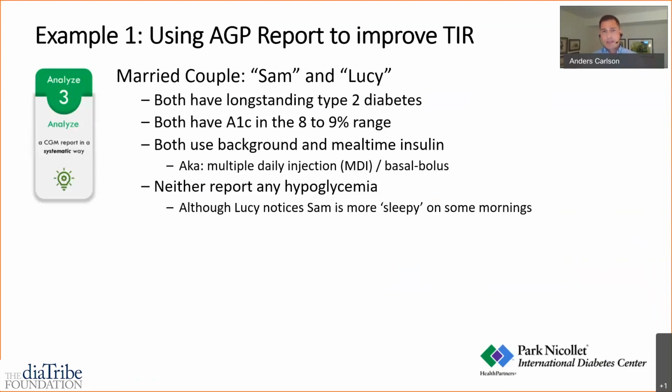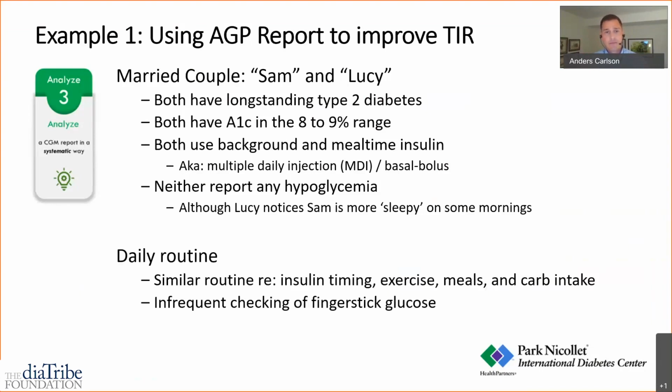And neither one of them really endorses symptomatic hypoglycemia. Lucy does say, though, that Sam on some mornings seems a little bit more sleepy than he is other days. But no one really has had any significant hypoglycemia to speak of. And what's interesting is both of them have very similar routines. They probably couldn't be more similar in terms of sharing the same meals. They go on walks together. They take their insulin at the exact same time as each other, and they both use finger stick glucoses, but don't check all that much.